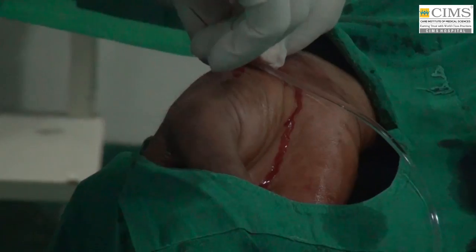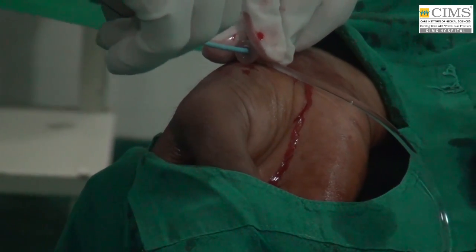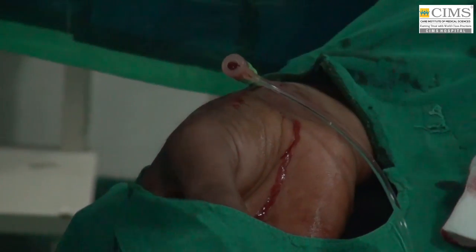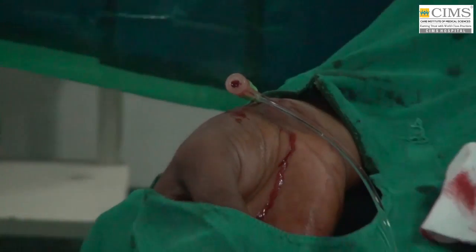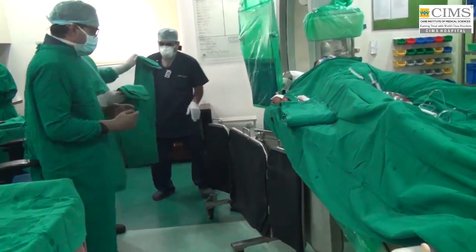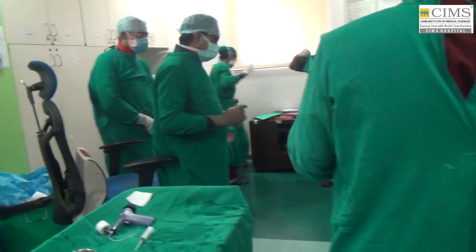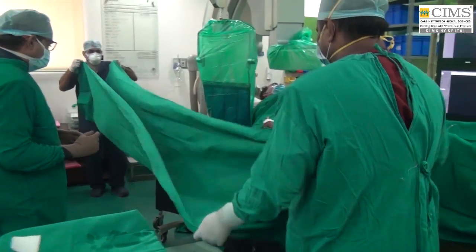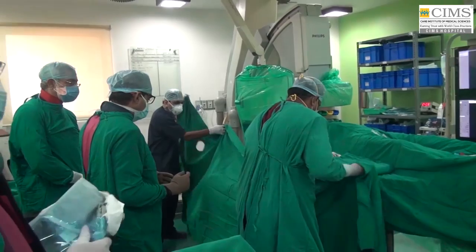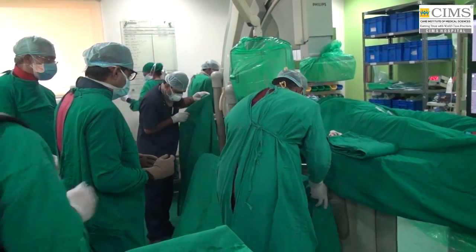Yes, Dr. Keyur, and this is particularly relevant to our Indian patients whose radial diameters are not as large as in the Western population. Correct. Now also with a 7 French guide, if this lesion turns out to be chronic with a dissection, and we have to use different hardware, including more support if required, then a 7 French guide can be very useful.